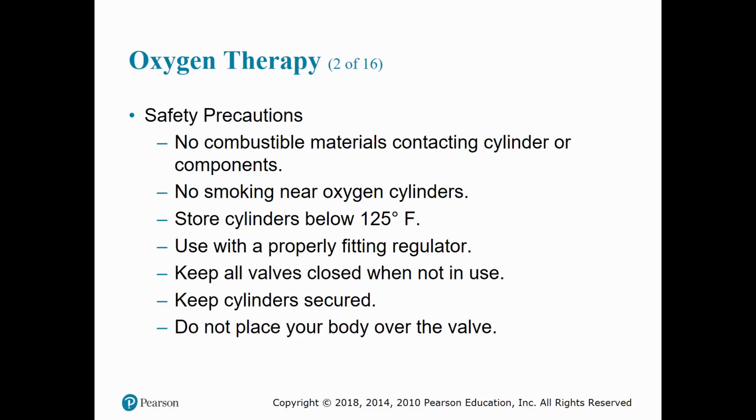Make sure also that all cylinders are secured to prevent them from toppling over. In transit, they should be either secured to a stretcher or in a carrier tank. They should never be unsecured anywhere in either the patient or driver compartment. When you are working with an oxygen cylinder, never place any part of your body over the cylinder valve.